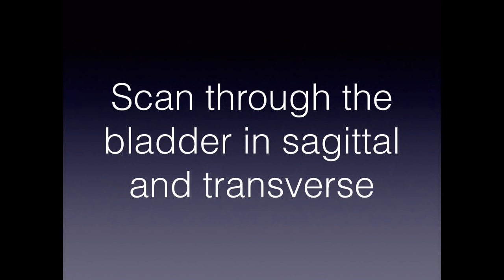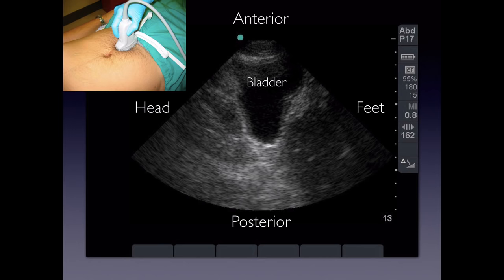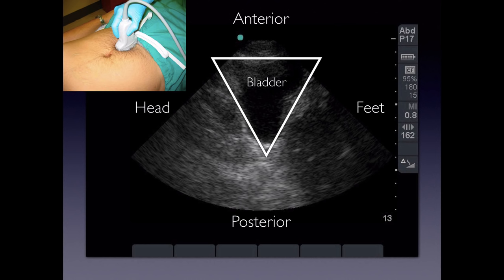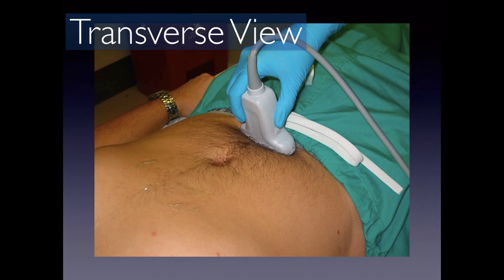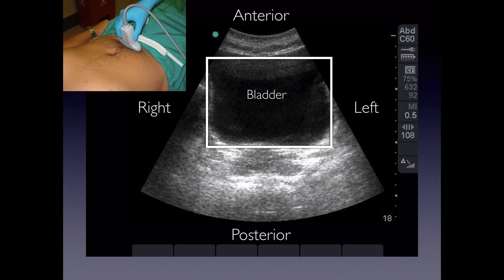To scan the bladder, position the probe right above the pubic symphysis and press straight in, angling back because the bladder sits behind the pubic symphysis. If it's not very full, you'll have to rock back to find it. We start in sagittal with the indicator towards the patient's head, getting a triangular-shaped bladder. Then rotate the probe with the indicator towards the patient's right for the transverse view, giving a more rectangular appearance. Anterior-posterior orientation remains the same in both views.